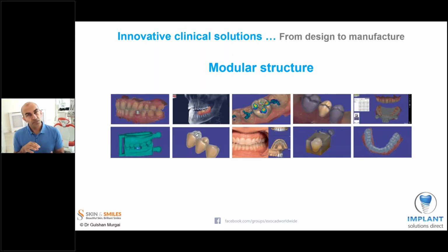There's also what's called a smile creator module for the fabrication of anterior smile design, multiple unit cases. It allows you to create bite splints as well as 3D printable models. So there is a significant amount of modules available that you would speak to your reseller about and say, well, I need this, and you only purchase what you require for your needs.